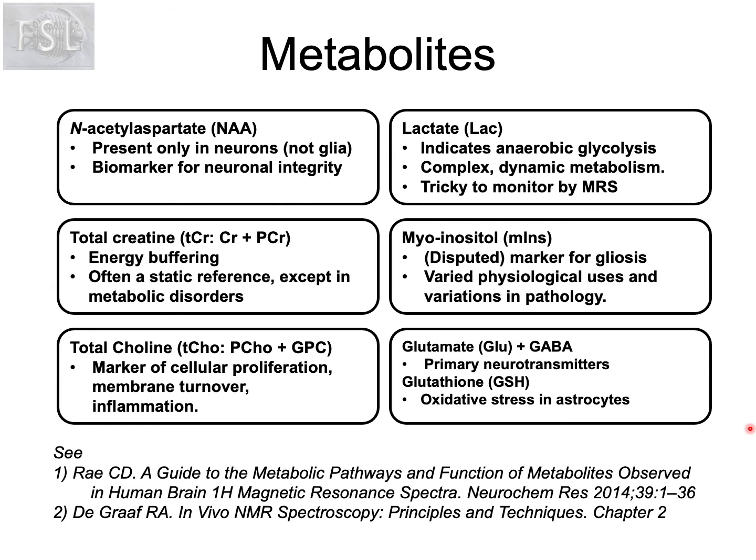Nevertheless, this slide gives a very brief summary of the most prominent metabolites in proton MRS, and some metabolites have very clear compartmentalization, such as NAA, which is almost entirely neuronal, but conversely, the oft-stated compartmentalization of myoinositol to glia is probably an oversimplification.